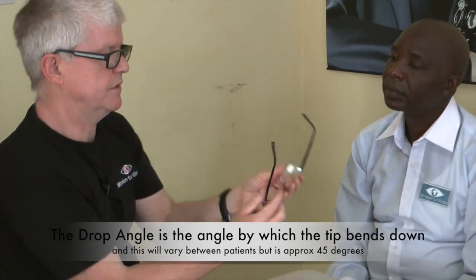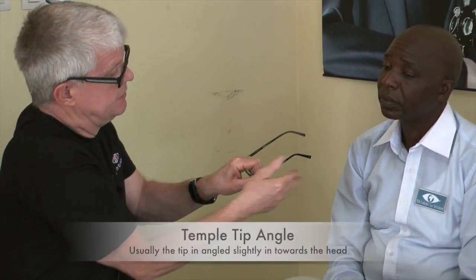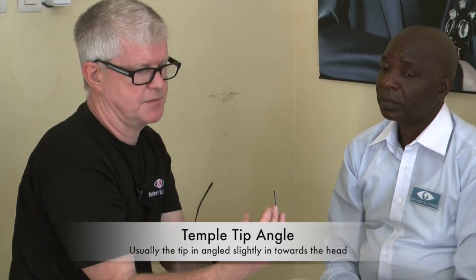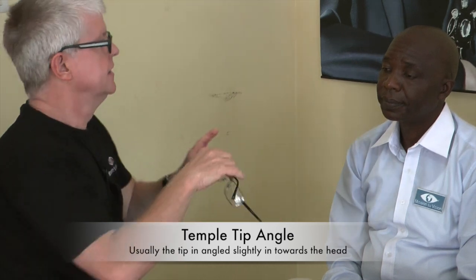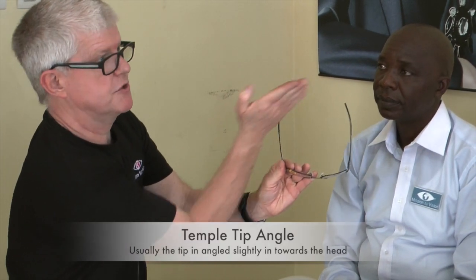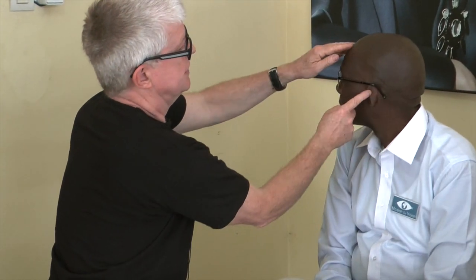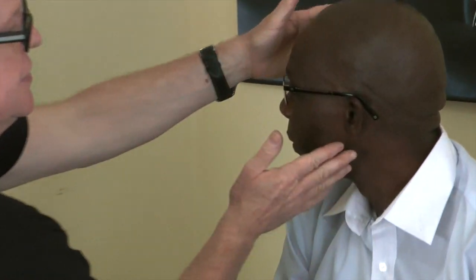So we've done length to bend, we've done the head width. The other is the angle of the side tip and how it goes inwards, usually, but everyone's heads are different. So sometimes you need that tip to be bent outwards if they have a bony piece here. I've adjusted the frame and bent it right in, and you can see that it's not fitting very well — this is pushing the side out and it's not going to be comfortable.